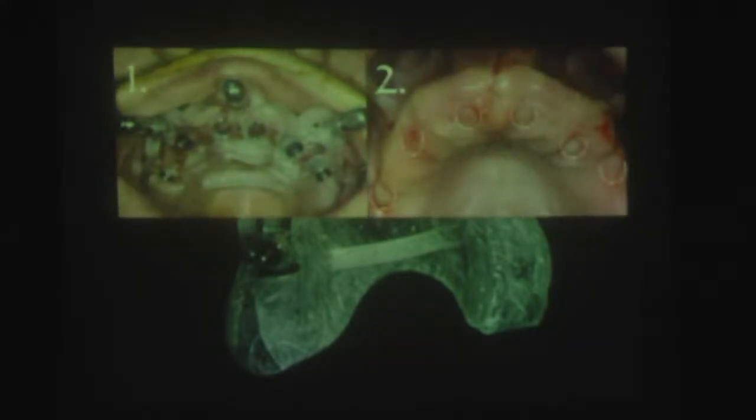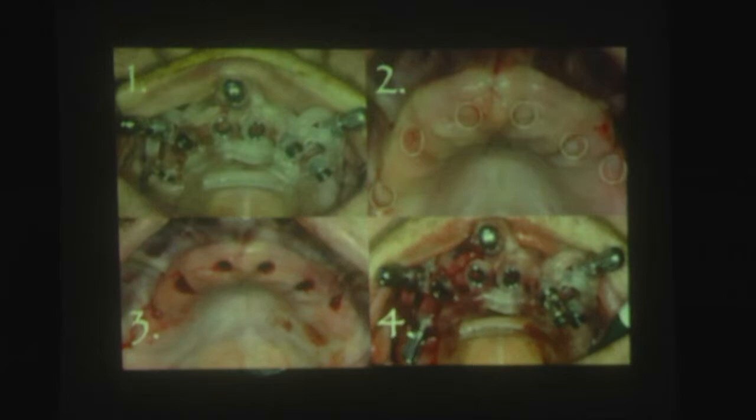And the first step, we fix it. Look, my friends, I want to tell everything. These are fixation pins. This is the first fixation item. You know, we have 2 more. Once you make the first drill, then you can take anchorage from the first drill. This is what we call socket anchorage. And once we place the implant, we can get the anchorage from the implant. So we have 3. Please don't pass over these items. It's very important. Look, this is a socket anchorage instrument. And later I will show you an implant anchorage.